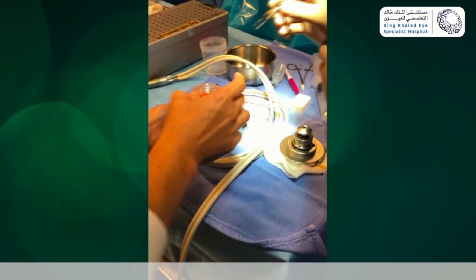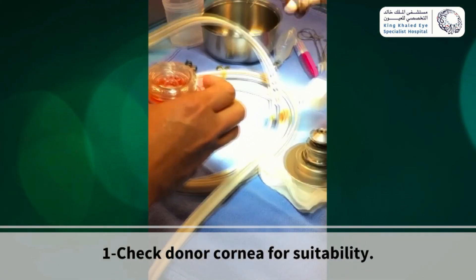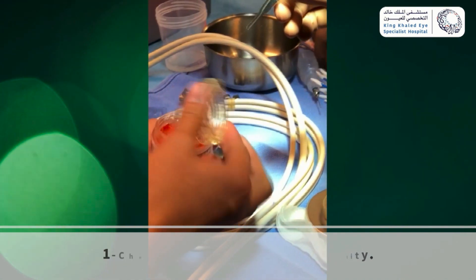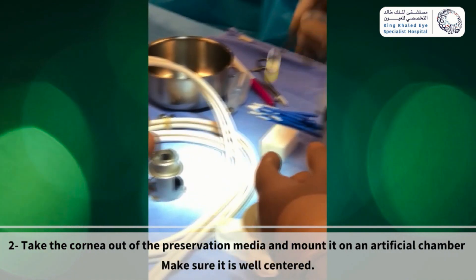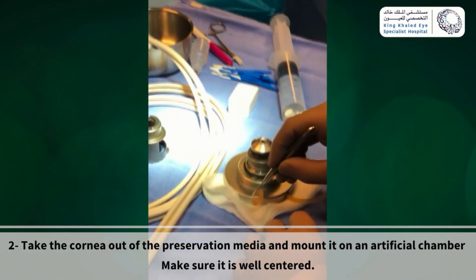This short video demonstrates corneal donor tissue preparation for DSAEK. After checking corneal tissue for suitability, in a sterile field, use your forceps and grasp the cornea carefully by the scleral rim from the preservative media.